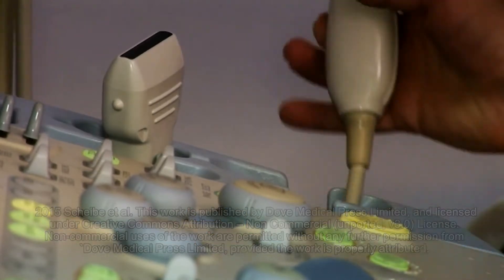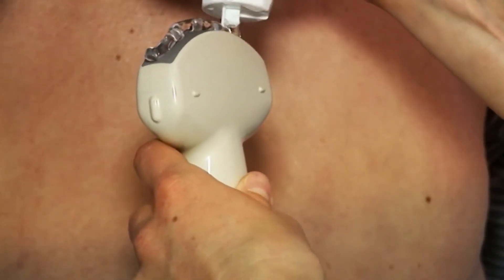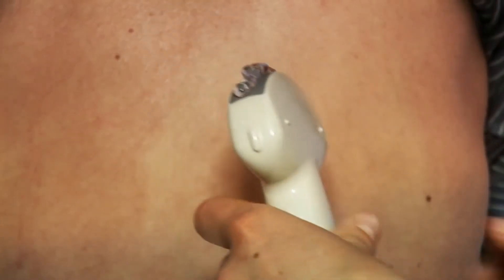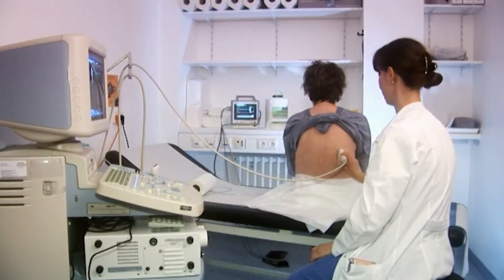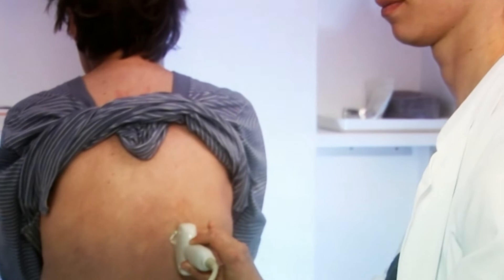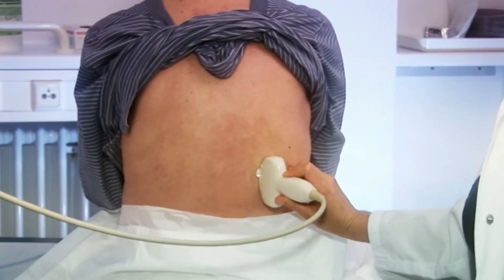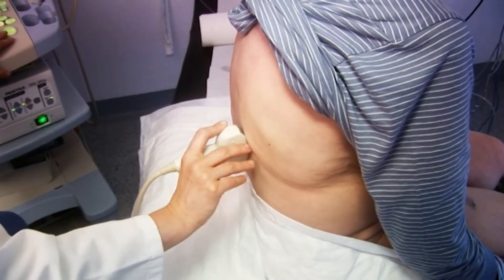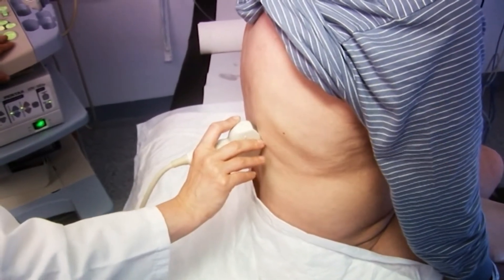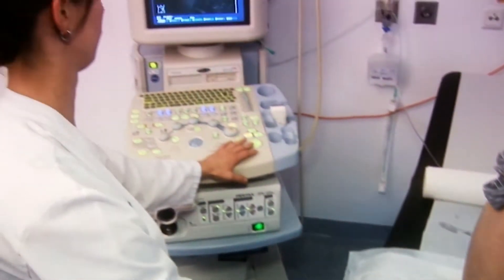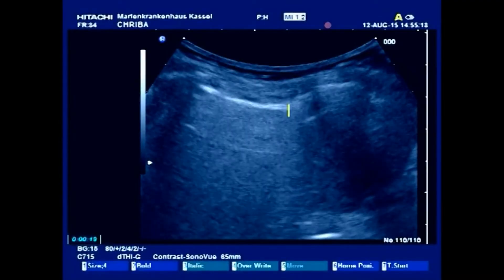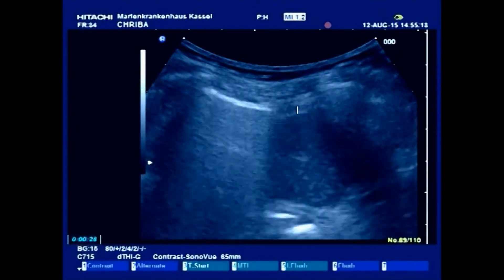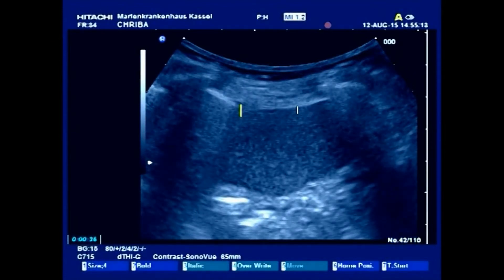We want to demonstrate our way to estimate diaphragmatic dysfunction. The method we use is somewhat similar to the old-fashioned method of lung percussion, but now with technical support. With the help of this approach, we do not visualize the diaphragm directly. We only measure the up and downward movement of the lung silhouette on both hemidiaphragms. The downward movement of the lungs is mainly the result of the diaphragmatic work.